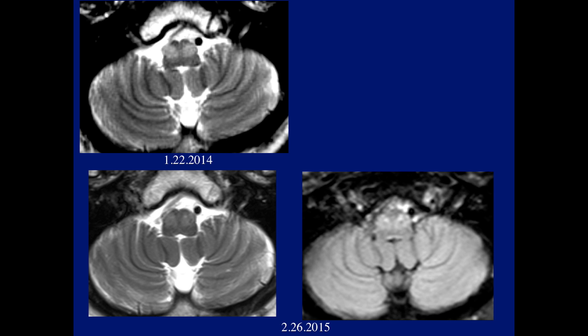Here's an interesting case that Stefan and I looked at. The patient was examined because of severe vertigo. We saw hypertrophy and abnormal changes involving both olivary nuclei, as you can see on the initial study. On follow-up there are reduced changes, although still abnormal on FLAIR.